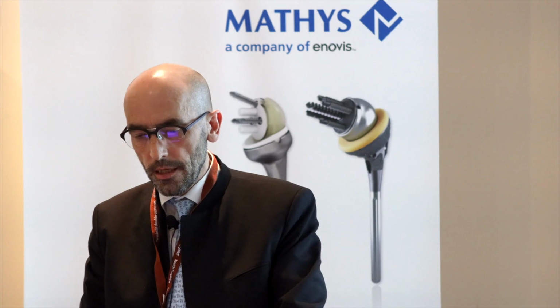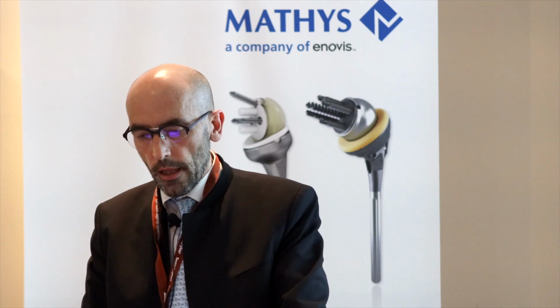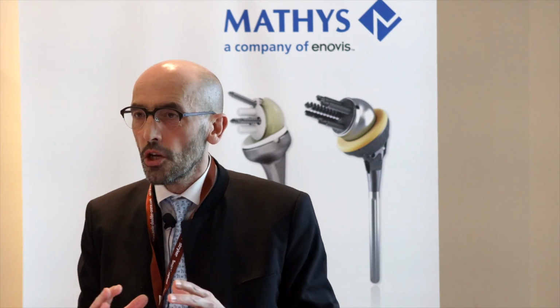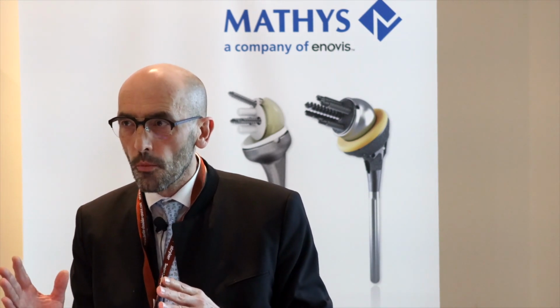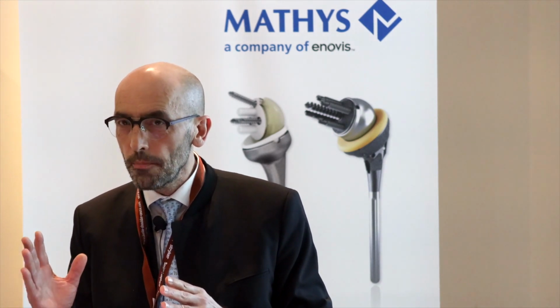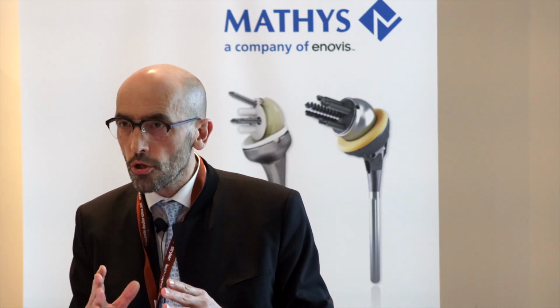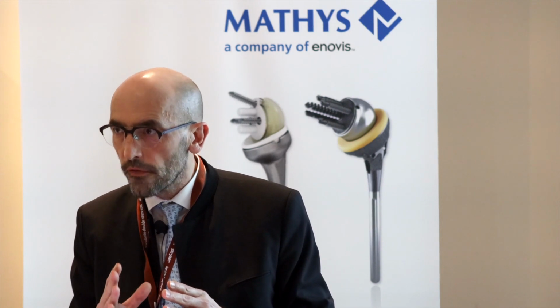So as you can see here, this is a normal shoulder, and what we need to understand now is the fact that reverse shoulder arthroplasty should not be so far away from a normal shoulder. We should keep in mind that our goal is to be as close as possible to a normal shoulder, even if it's a reverse one.